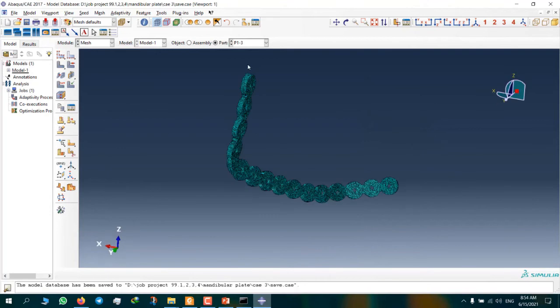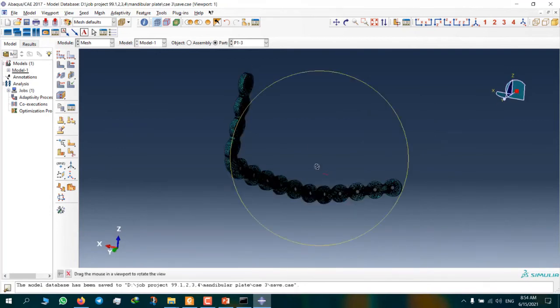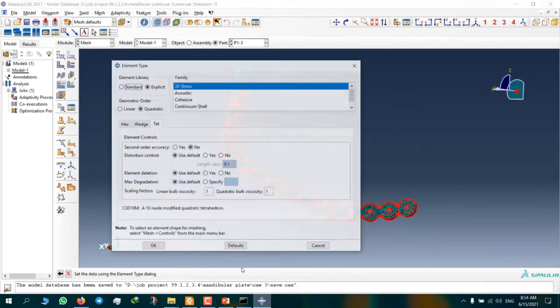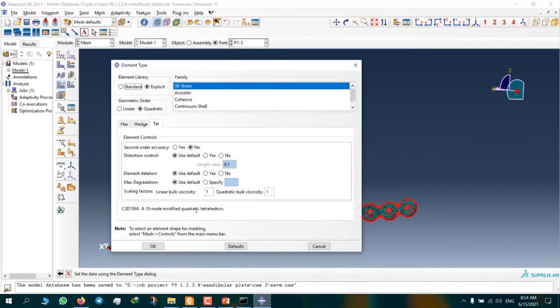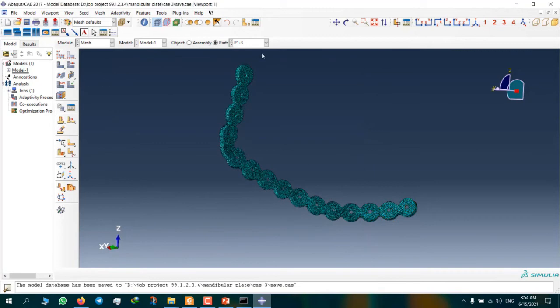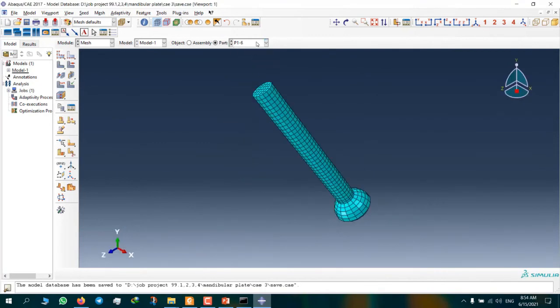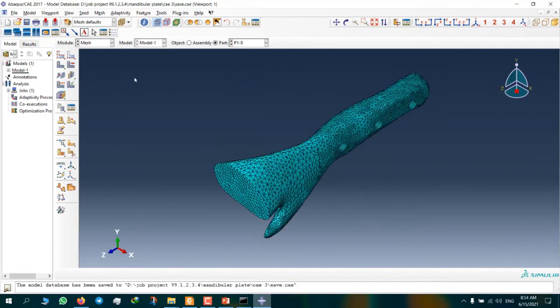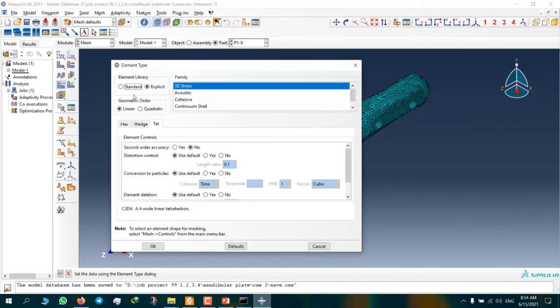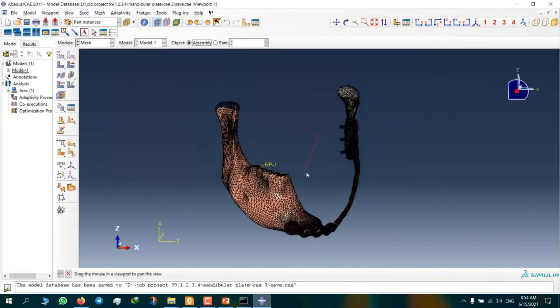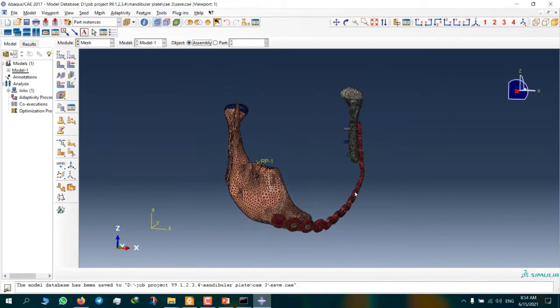Now for a mandibular plate, we can use C3D10M element. And for a bone, we can use C3D4 element type. This is linear. This is our model with mesh.